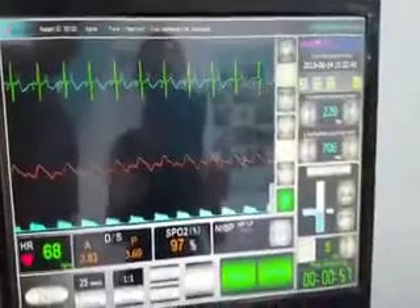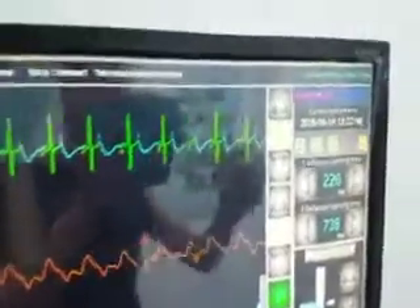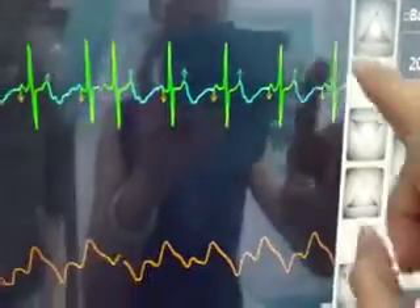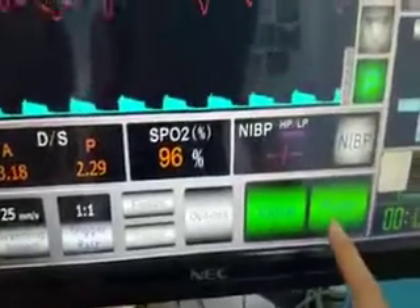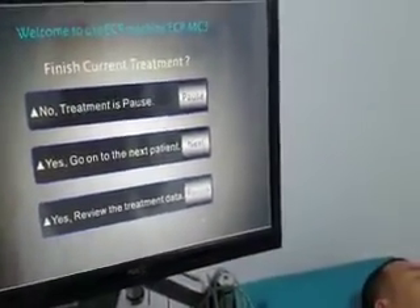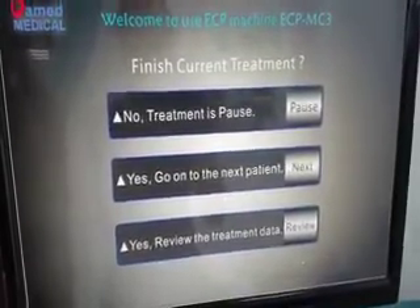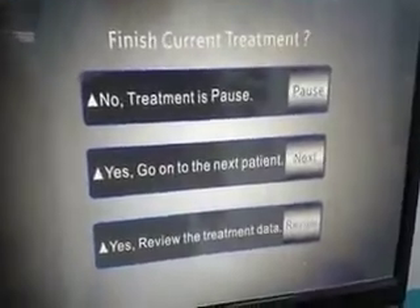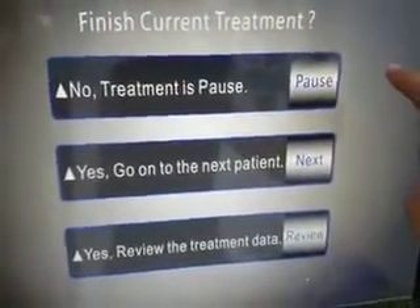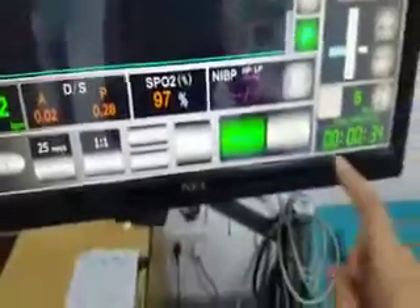The machine now has 55 seconds remaining. You can see the monitor is locked, and we can unlock the monitor display. We can also stop the pump in the middle of treatment — you will hear the pump sound stop. If the patient needs to go to the toilet mid-treatment, press Pump to pause. When the patient returns, press Pause then Pump to continue treatment for the same patient.